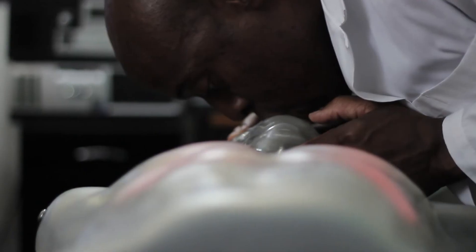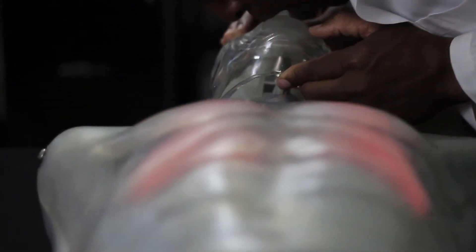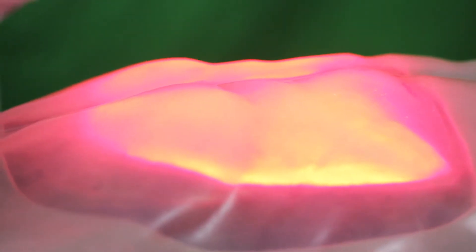However, if you don't pinch the nose, the air may escape through the nostrils. This mannequin gives a more realistic approach to giving breaths.